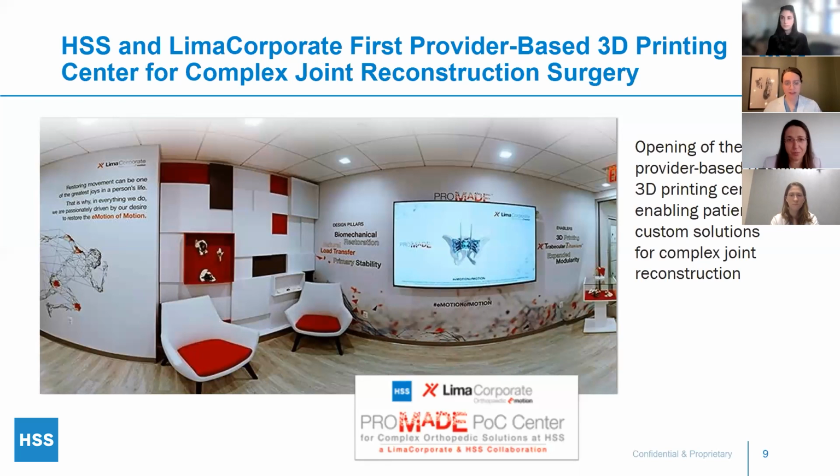And just to chip in, this has been a huge area for foot and ankle surgery as well. Again, it's not typically for that first-time patient, but in the revision setting, in a patient who had an ankle replacement, who maybe had it 20 years ago and it worked wonderfully, but over time they've started to have loss of bone or wearing out. The bones of the foot are not very big, so you don't have that much room left. So we can actually 3D print entire bones.